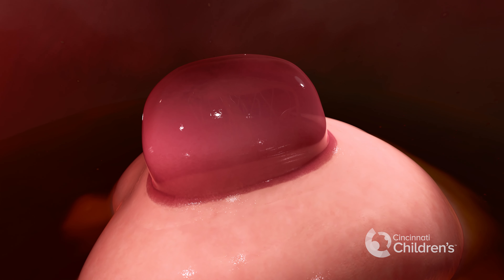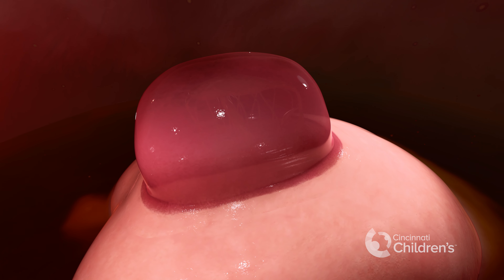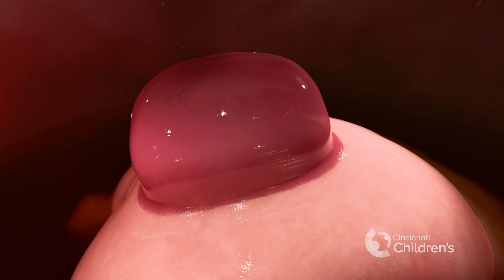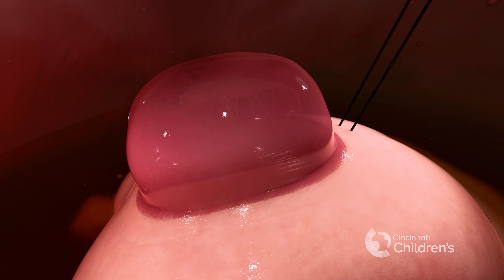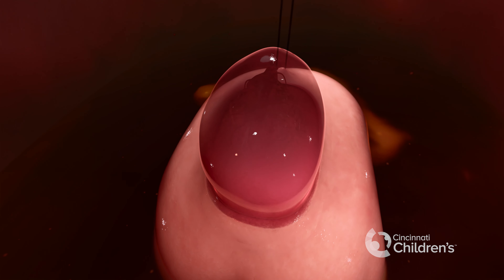We inject a cocktail of pain medication, paralytics, and medication to protect the baby's heartbeat into the gluteal muscle. We then place a stabilization stitch in the baby's upper back above the spina bifida.